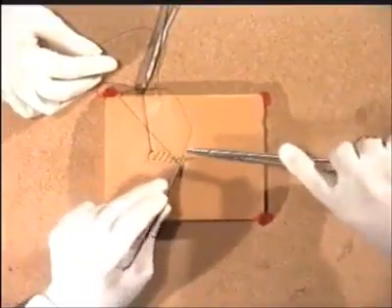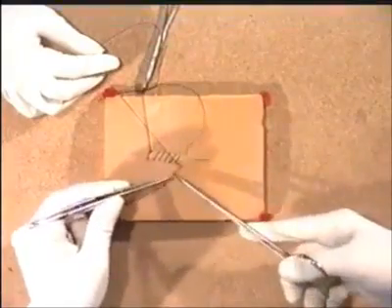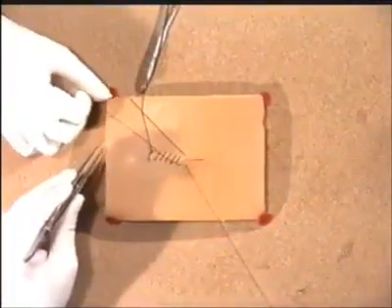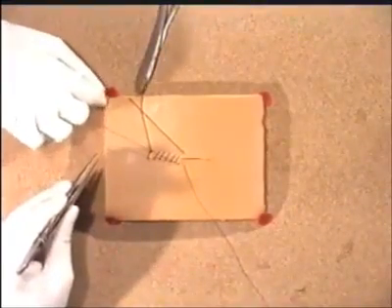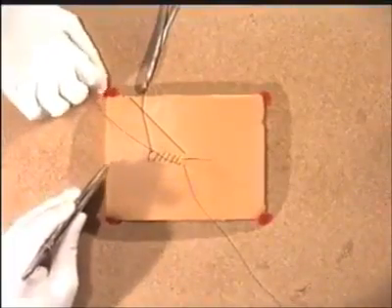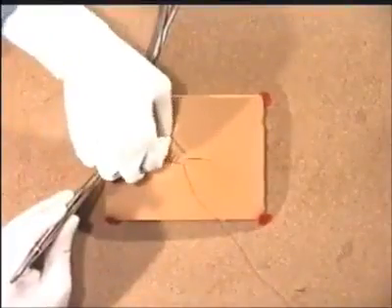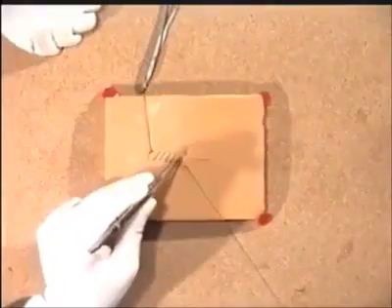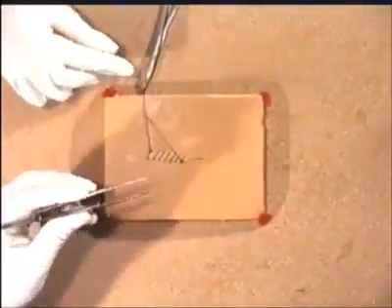Unfortunately, in this case, the assistant was not alert, and allowed the suture material to twist around an instrument. It now becomes increasingly difficult to untwist this, and panic sets in. The assistant then starts to put their hand into the middle of the surgeon's view, which is even worse, but eventually the suture material is freed. Pass it again to your assistant, who will be wary for the rest of the operation.